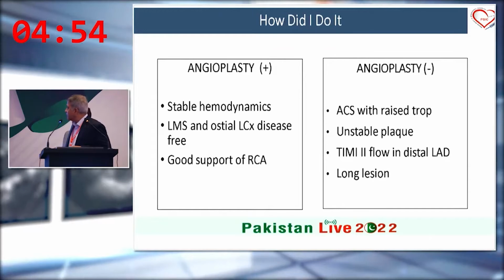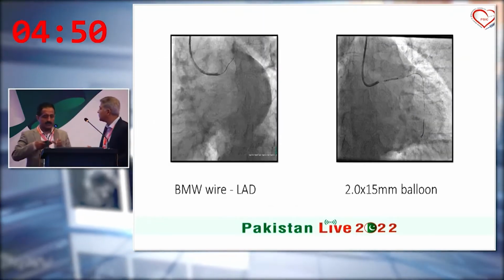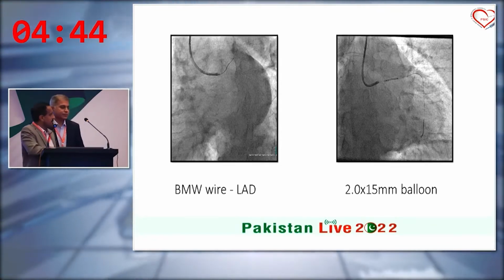How did I do it? Let's have a quick discussion for 5 minutes with the panelists and ask how they would do it, and then we can discuss. So, Dr. Afsar Raza, if I ask you, what would you do in this case? Would you consider just ostial nailing or come into the left main, or how would you proceed?